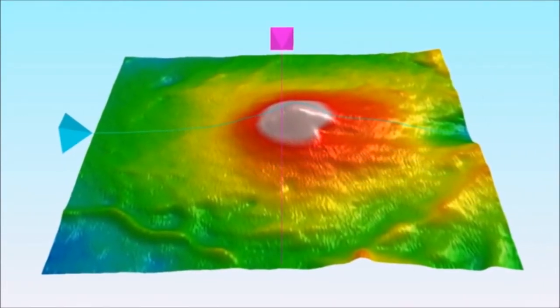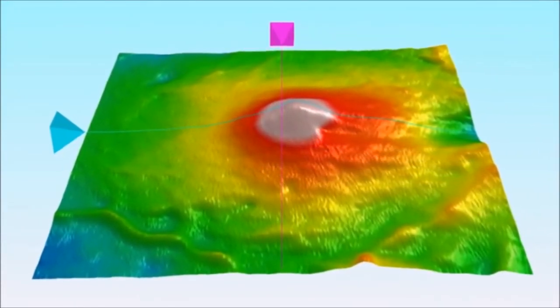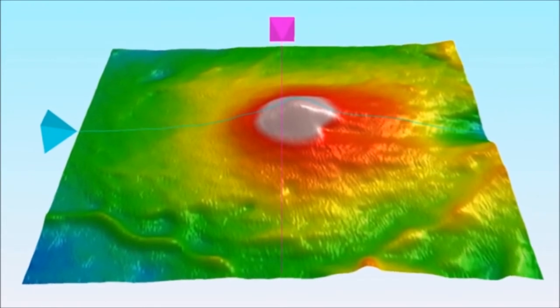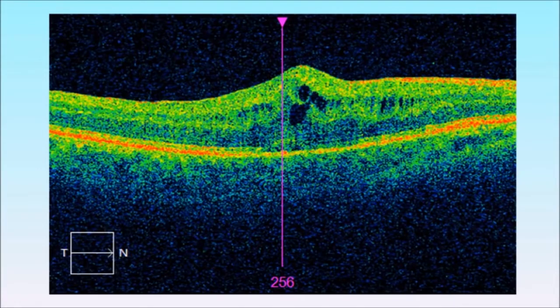This 3D scan shows a blister of interretinal fluid that has occurred following cataract surgery. The location of the fluid is shown clearly on the 2D OCT section. We treated this condition with steroid eye drops until a normal retinal profile returned.